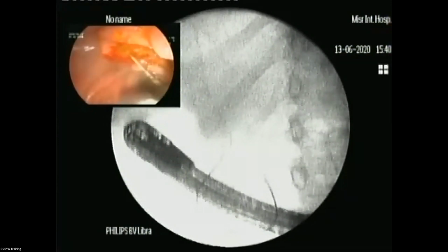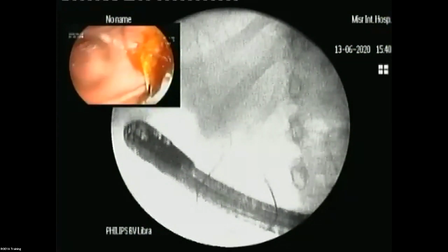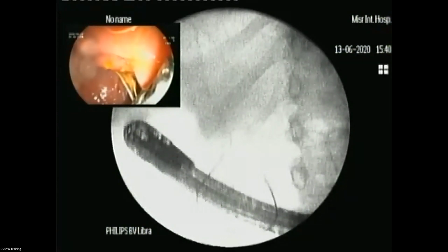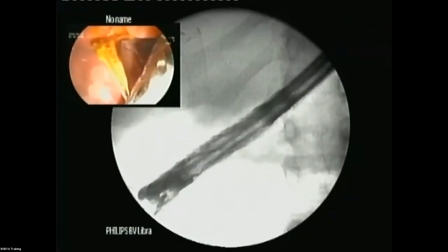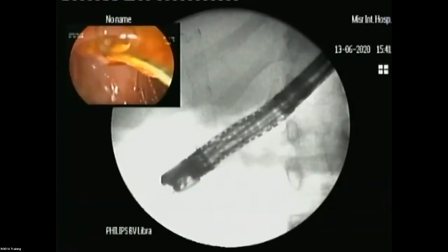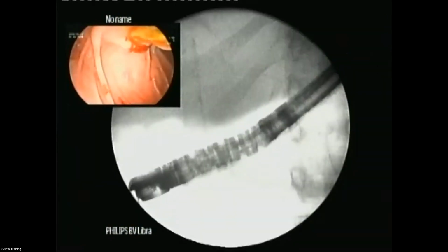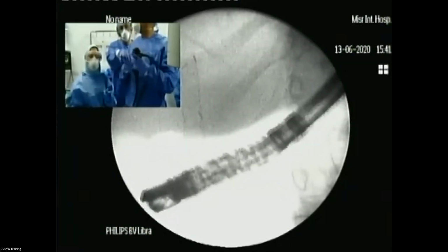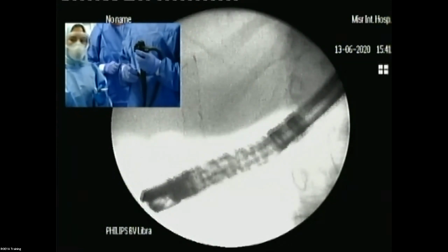So open. By the way, Mustafa, did you see the lasso of the distal part of the metallic stent? Yes. Is it clear? So we catch it now, and then Hani will start pulling. You can fix on his left side here. It's very important when you start pulling anything to fix this part. So when he starts pulling the scope, he will.